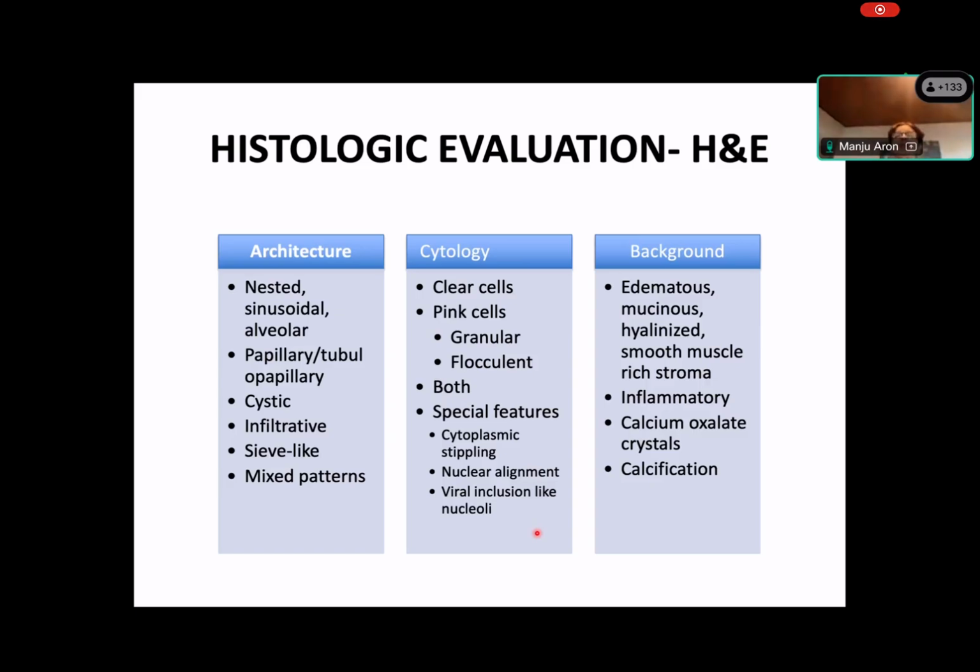And then, of course, last but not the least, look at the background. Is it edematous? Is it mucinous? Is there a lot of smooth muscle stroma? Are there calcium oxalate crystals present? Are there psammoma bodies? Is it very inflamed? All these things put together help us arrive at a diagnosis.